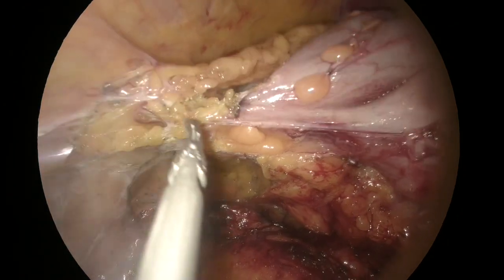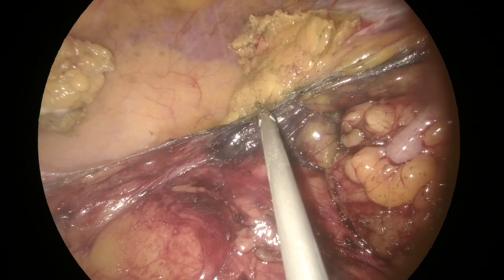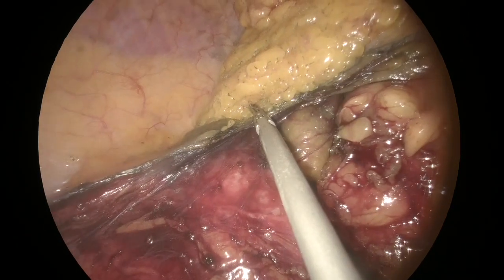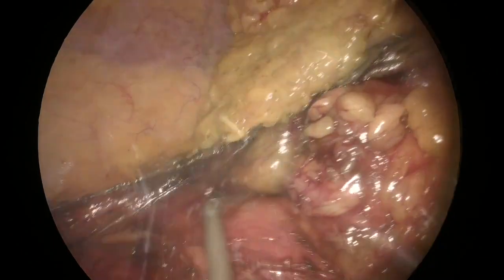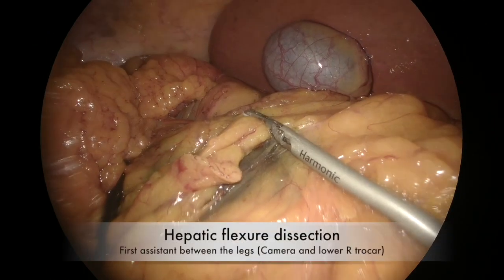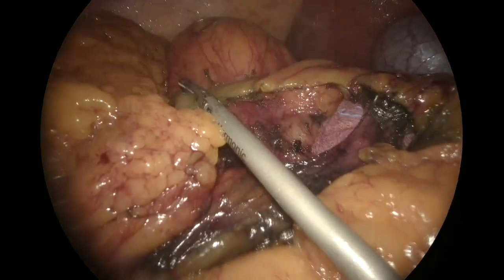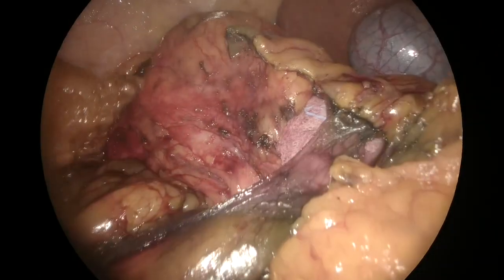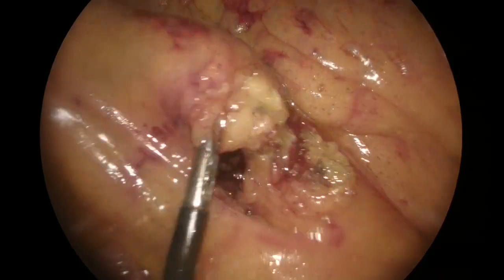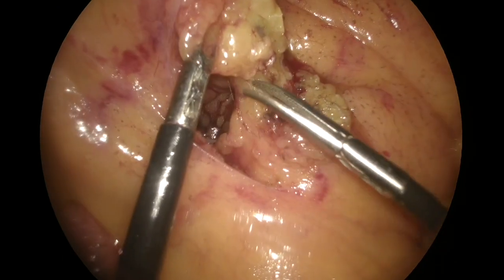After, the right paracolic gutter was opened using an ultrasonic device up to the liver. The hepatic flexure was then taken down, with the surgeon now operating on the left side of the patient.